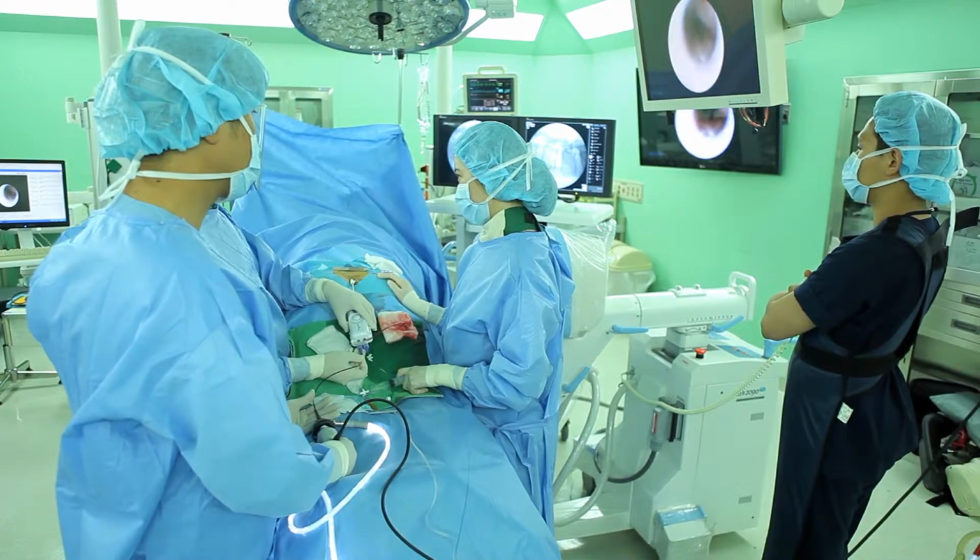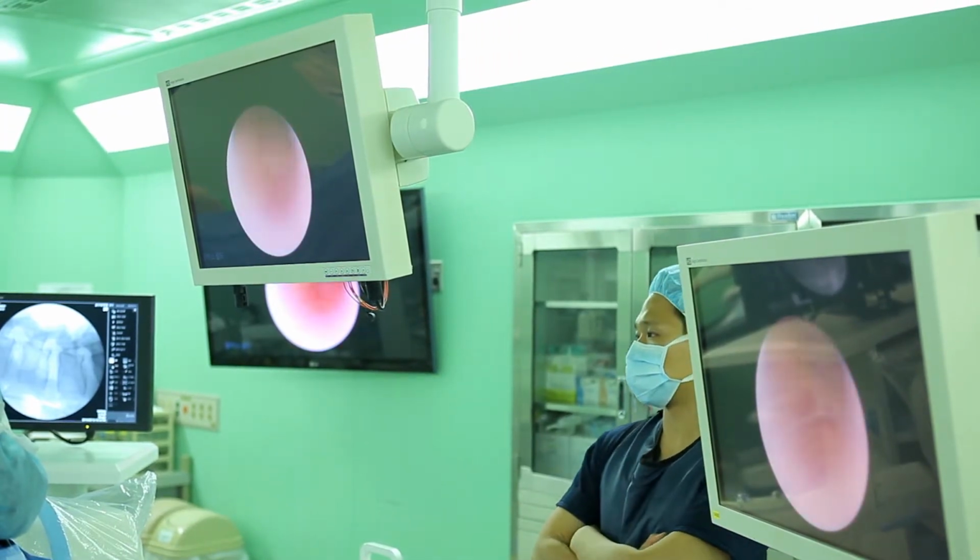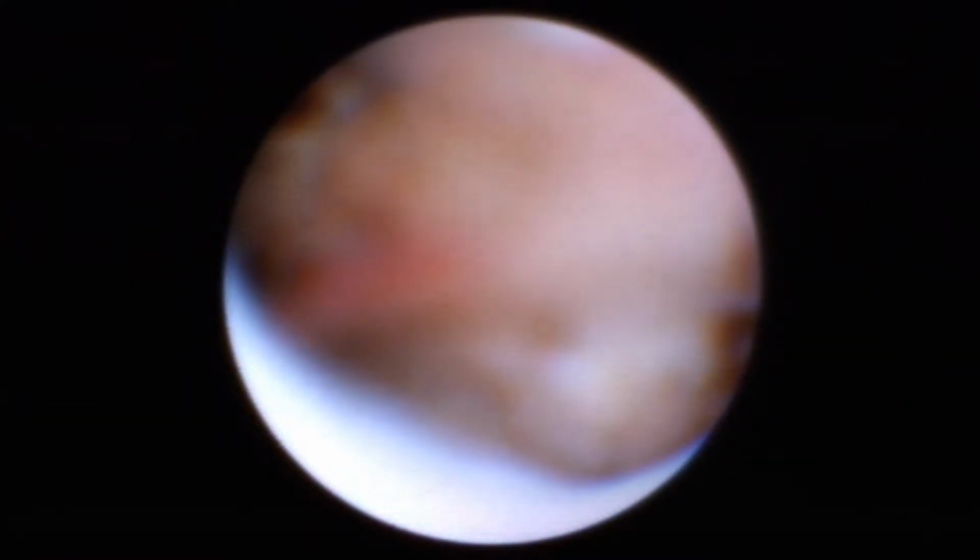Disc particles coming from firing the laser come up with a full white view, which may be compared to a blizzard. The more blizzard, the more favorable the prognosis.